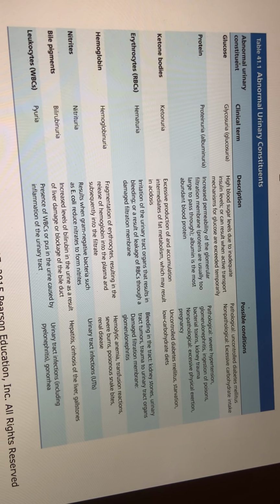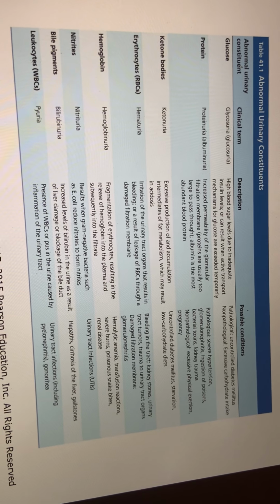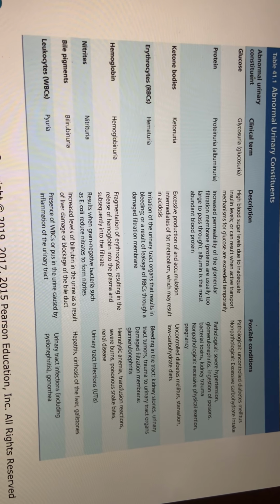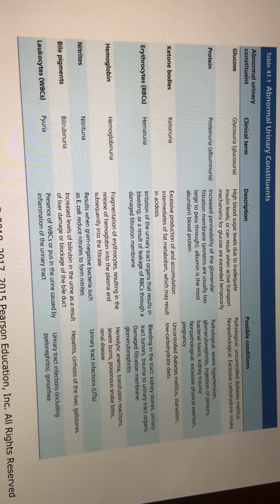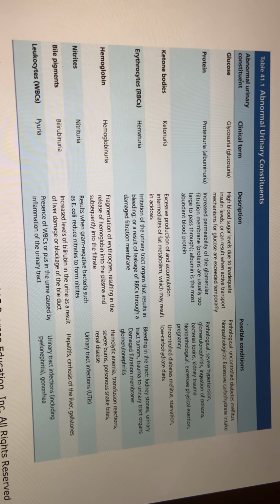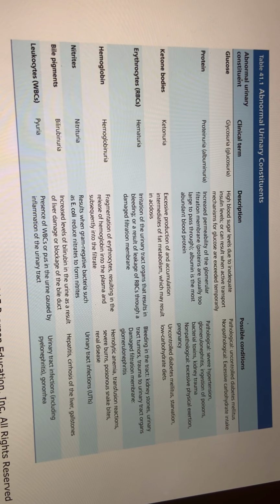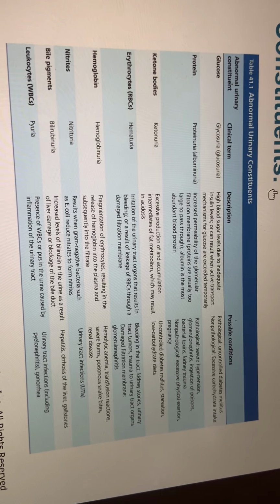So the transparency is still clear, okay? For the standard urine, slightly cloudy, okay? It's slightly cloudy, okay? For diabetes, you can say clear or slightly cloudy also in diabetes.